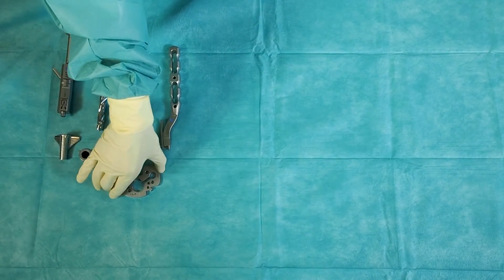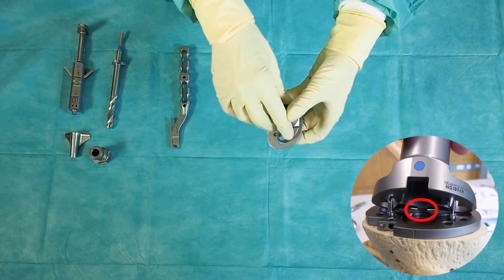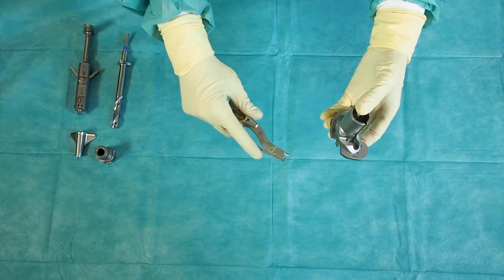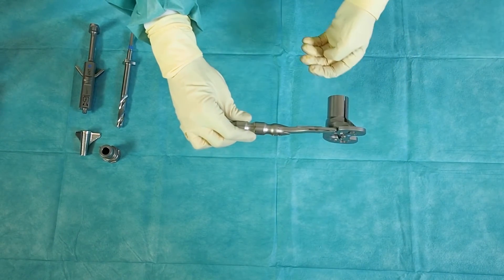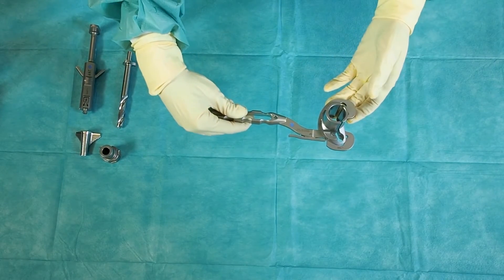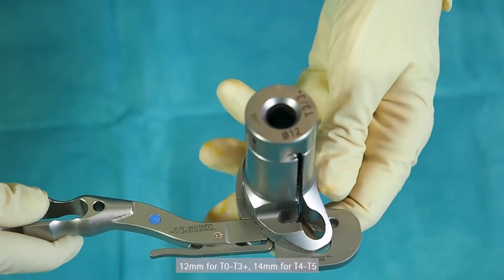After the trial tibia plateau has been positioned and fixed on the proximal tibia cut, the guiding tower is placed on it by engaging the posterior teeth first. Now the handle can be reattached to the assembly to lock it. According to the planned tibia size, the corresponding tibia drill sleeve is placed on the guiding tower.